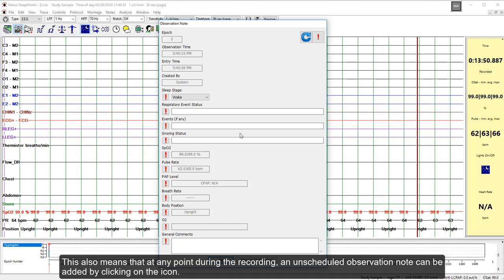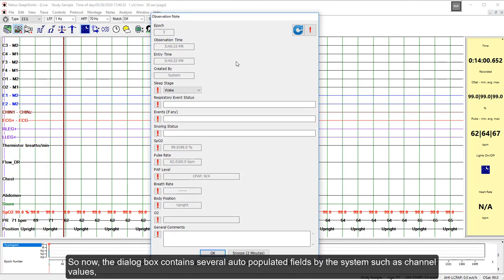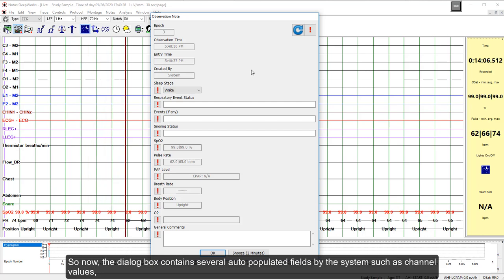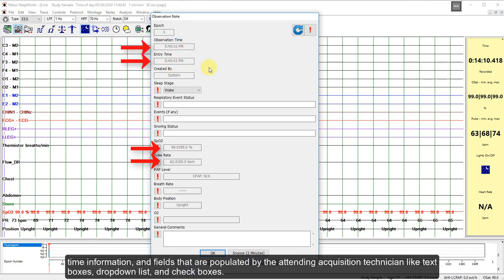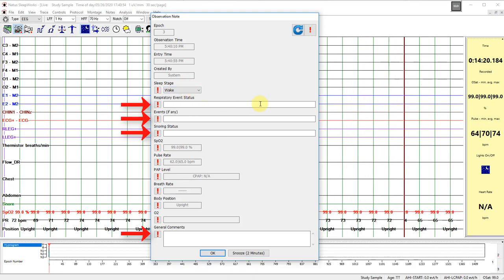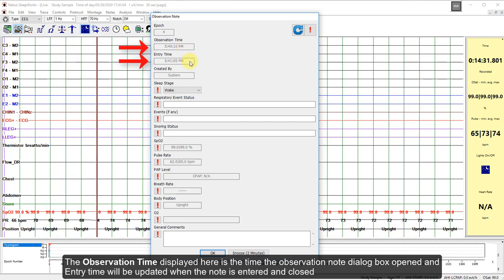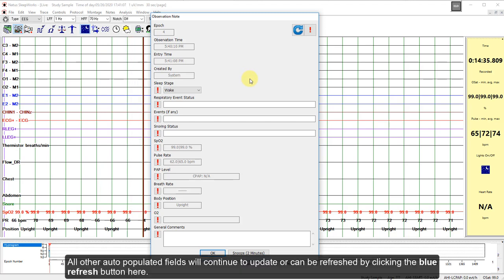This also means that at any point during the recording, an unscheduled Observation Note can be added by clicking on the icon. The dialog box contains several auto-populated fields by the system, such as the channel value, the time information, and fields that are populated by the attending acquisition technician like the text boxes, the drop-down list, and some check boxes. The Observation Time displayed here is the time the Observation Note dialog box opened, and the entry time will be updated when the note is entered and closed. All other auto-populated fields will continue to update or can be refreshed by clicking the blue refresh button.